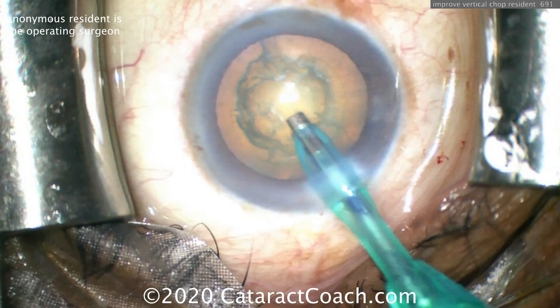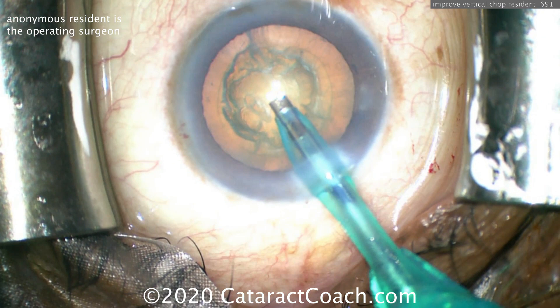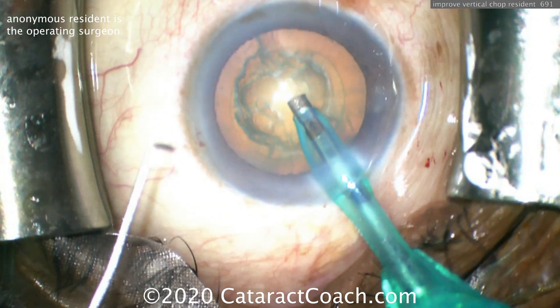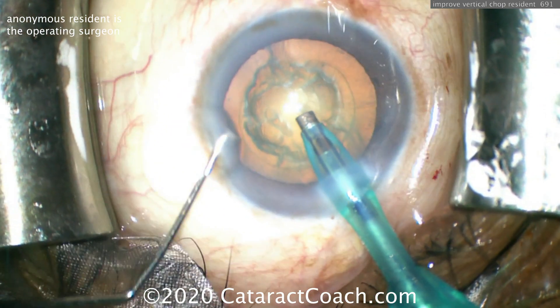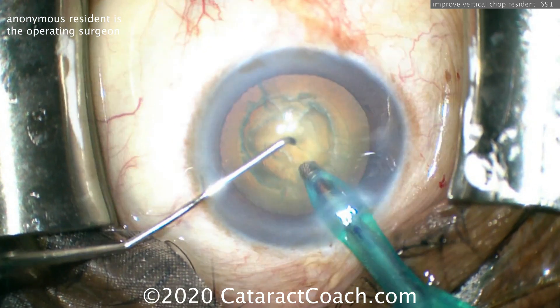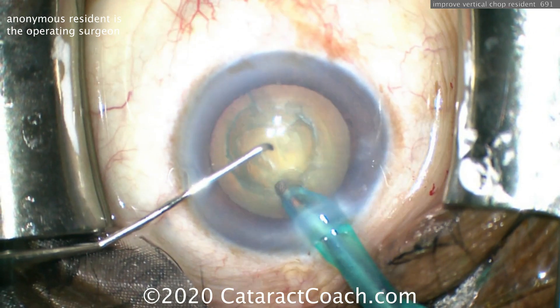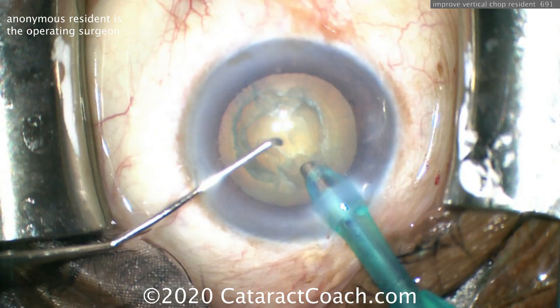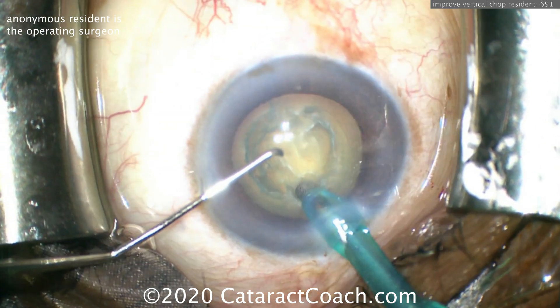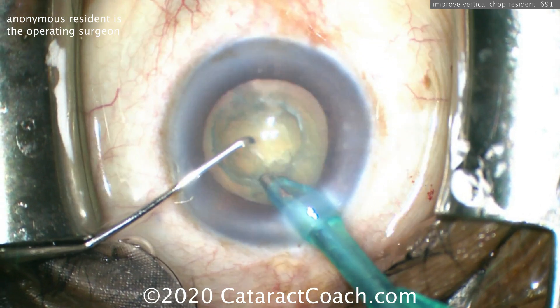Cleaning up that anterior cortex — that looks good. Hopefully the machine switched over to a high vacuum level now in order to achieve good holding power. Here comes the chopper going in the side port. I like the angle of the probe — that's really nice, angling there nice and deep in that central nucleus. Making a little bit of a pit first — that's a very good technique. Going to buzz in, hopefully occlude that tip and achieve high vacuum.